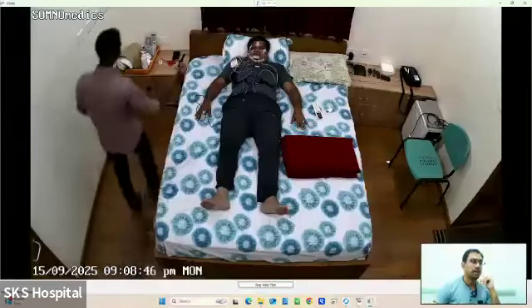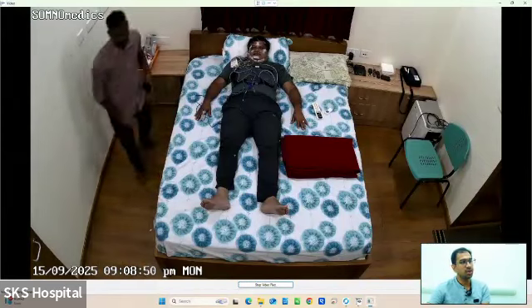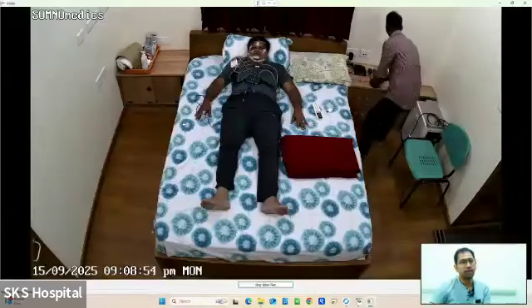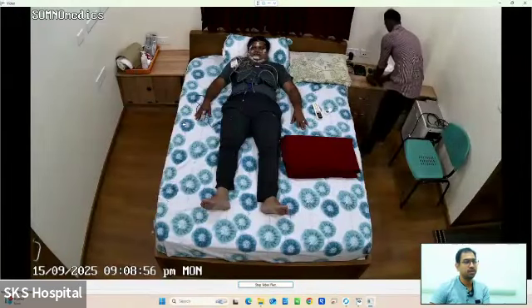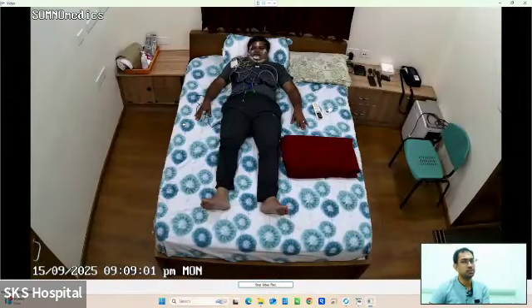They have to know that it is being told, so that they will do the same thing which we have to check on the sensors. Say for example, we'll ask them to take a deep breath, which will be reflected on the pressure sensor as well as the thermistor, which we have to see whether it is recording correctly. Because this biocalibration step is the most important step, because if some sensor is not working, this is the time which we have to fix it up.